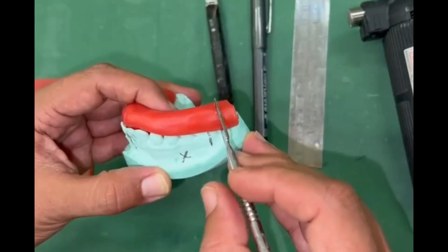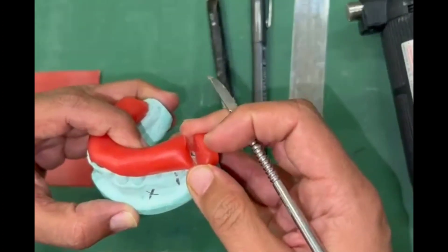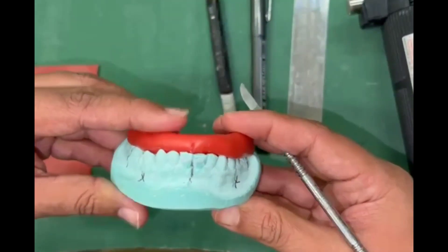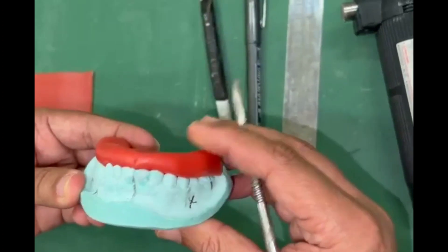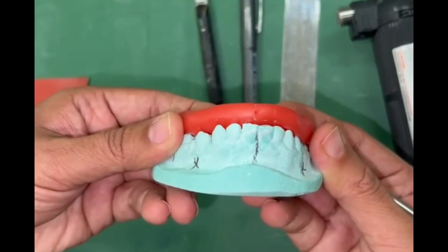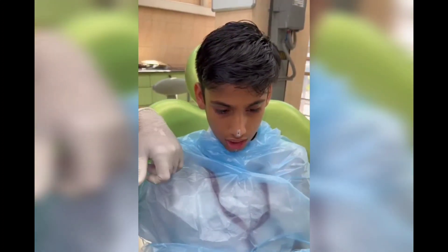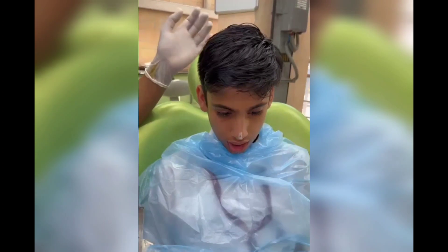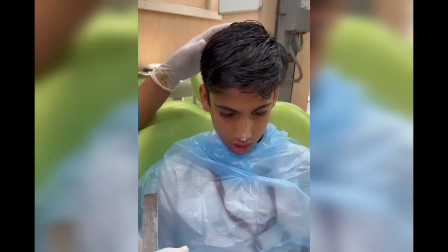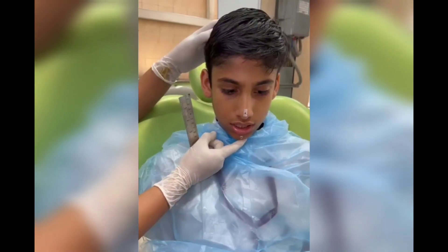The distal part of the wax sheet can be trimmed off like this. When you are making the horseshoe-shaped wax bite, instruct the patient to close at the desired position — they should be looking in the mirror and practicing their opening and closing at the right position.